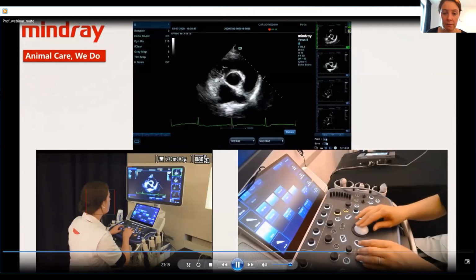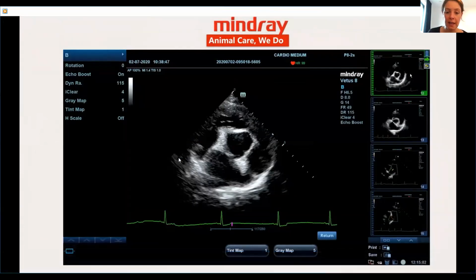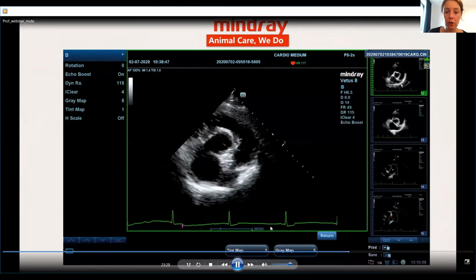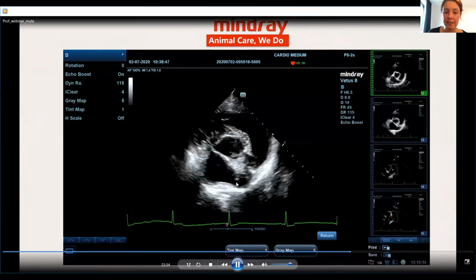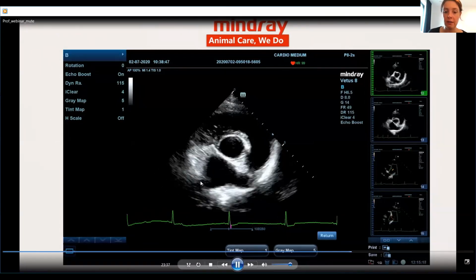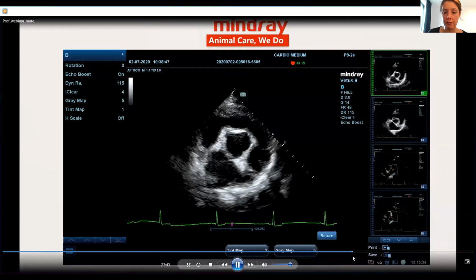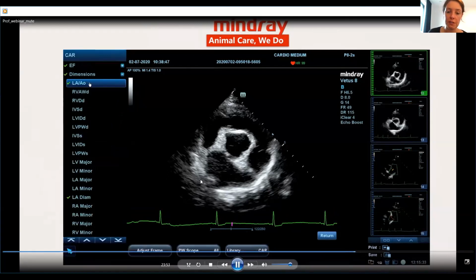Okay, then what I'm doing here is measuring left atrial size, and that can be a bit challenging. You need to find a good cycle where you can get a good delineation of the atrium, where you don't have too much disturbance from the pulmonary vein coming in here, and where you get a good view of the aorta. So I'm looking for a good place to measure. This is not super because it's a bit unclear here, but okay. It's a real life situation, so we will have to do it with that.